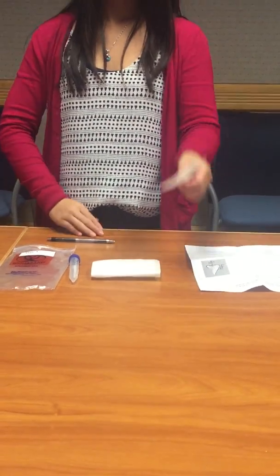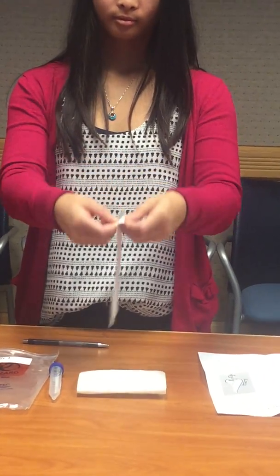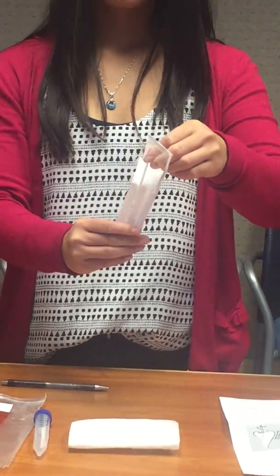Place the swab as far into the nostril as comfortably possible. While holding opposite nostril closed, slowly rotate swab and blow onto swab for at least 5 seconds.